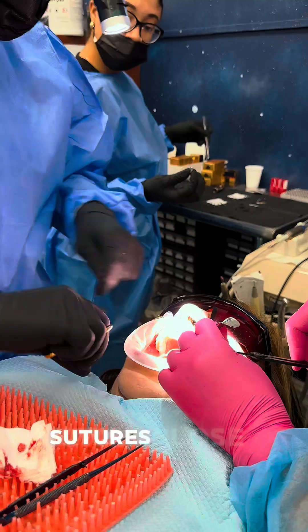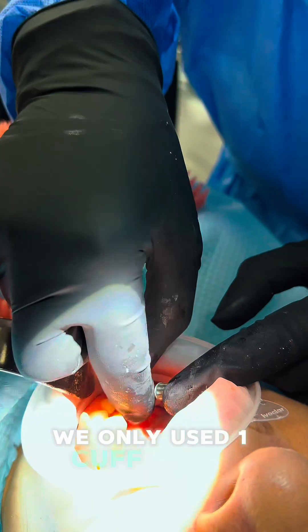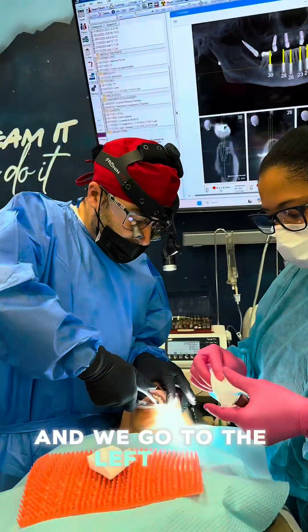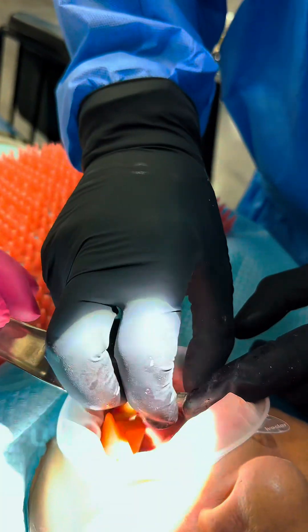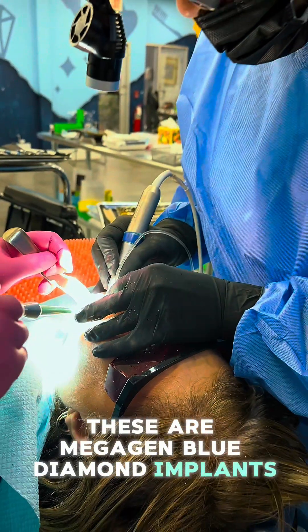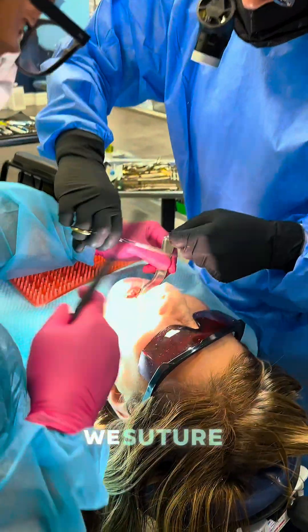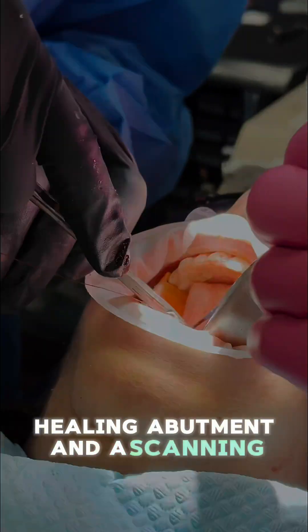We created enough vertical space for the implants, grafted the sockets, placed the multi-unit abutments, and sutured it closed. We placed the THS's - in this case using Shining, we only used one cuff height, the two-millimeter cuff height. Then we went to the left side, took out the molar and remaining teeth, placed the implants - these are Megagen Blue Diamond implants with great stability. The THS is a temporary abutment, healing abutment, and scanning abutment combined.